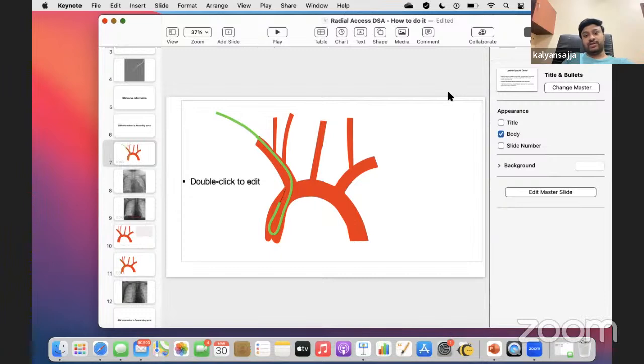And your procedures also, most of the procedures, I've been tracking almost 27 to 29 procedures that you have posted in WhatsApp. Maybe once you have used the stent retriever, that would be Trevo. For most you are probably attempting aspiration. Any particular reason for that? To keep the cost low. It's ADAPT technique. I use it twice.